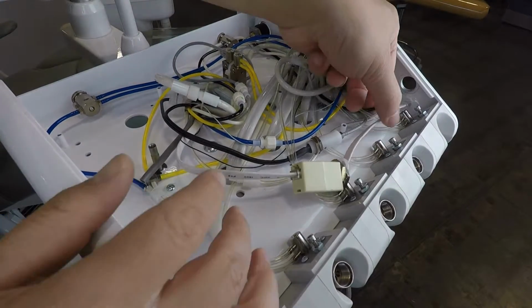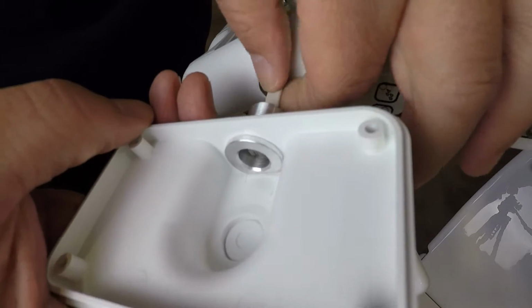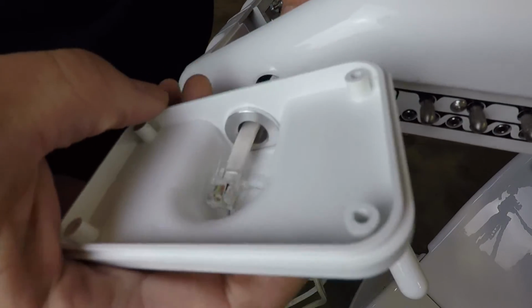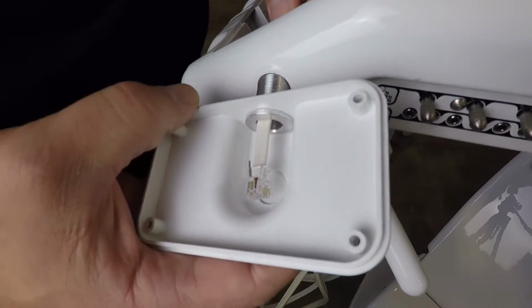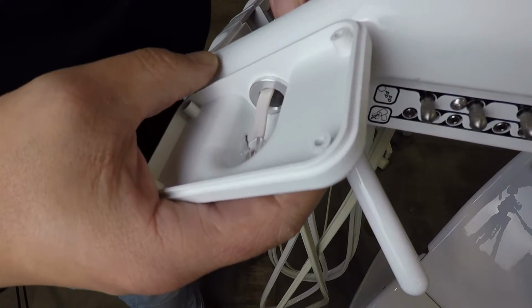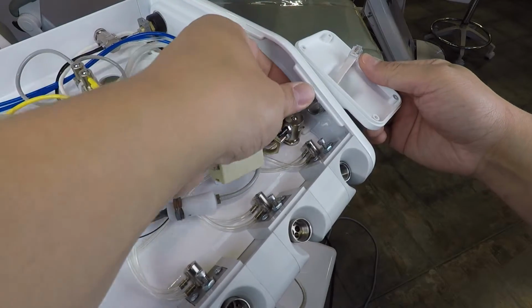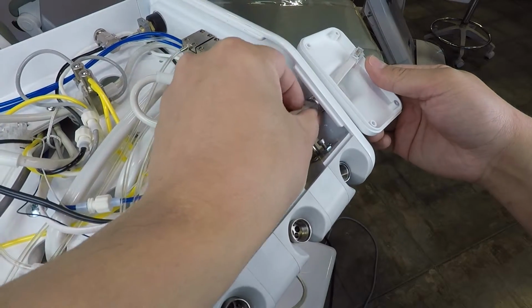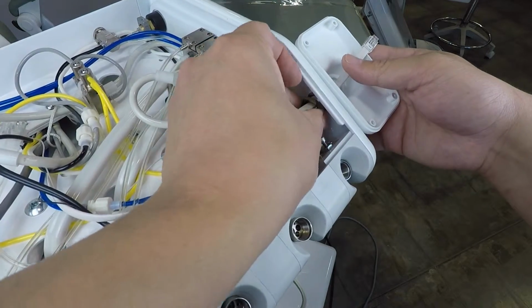Pull the open end of the 6-inch touchpad cable through the plug hole on the right side plate and through the swivel pin. Mount the touchpad bottom plate to the unit head by pushing the swivel pin through the side plate plug hole. Secure the touchpad bottom plate to the side plate by threading 1 washer onto the swivel pin. Tighten the first nut on the swivel pin, then tighten the lock nut against the first nut.